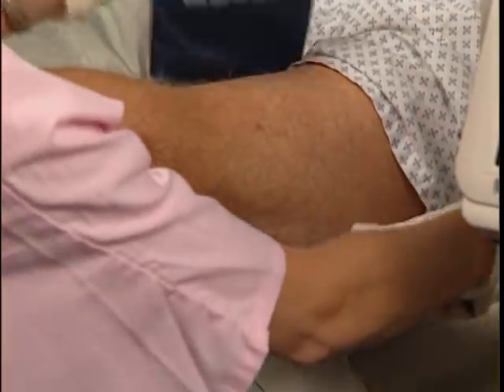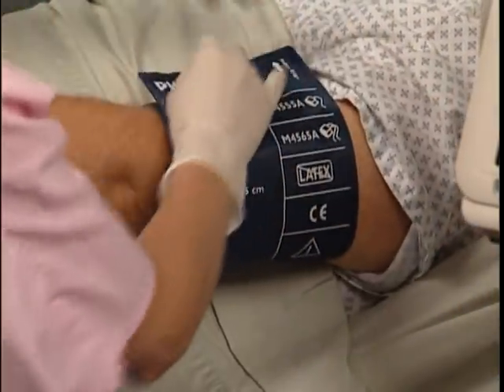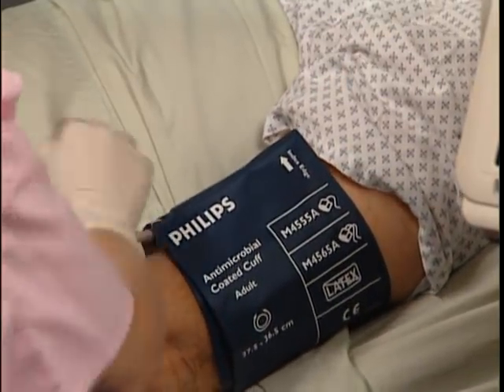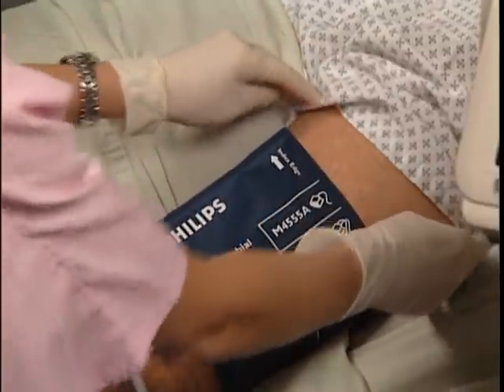When performing NBP, the first step is to select the appropriate size cuff. A properly sized cuff should span approximately two-thirds of the distance between the elbow and the shoulder and wrap around the limb.